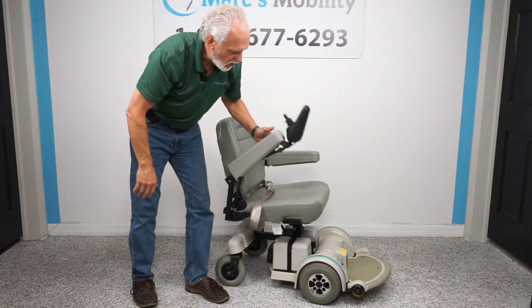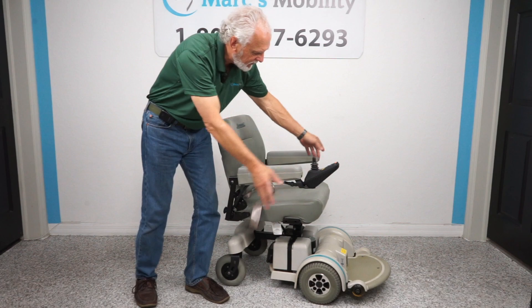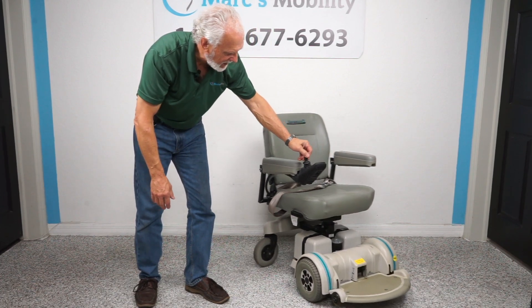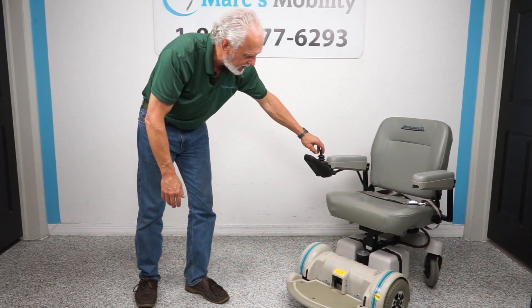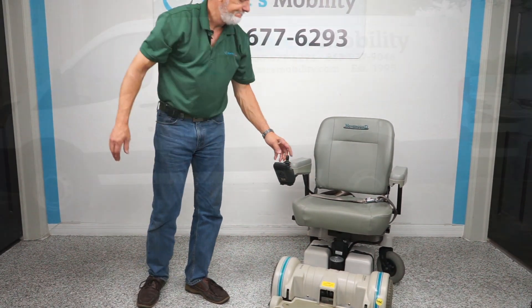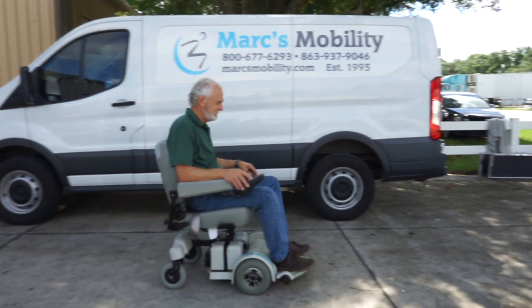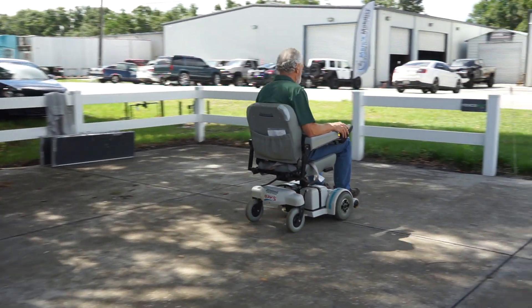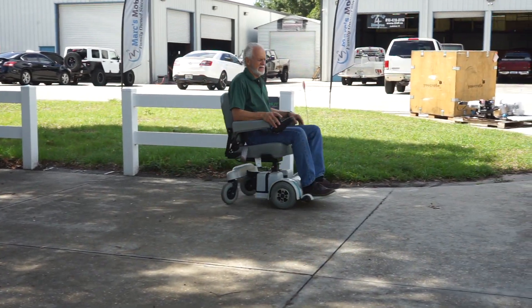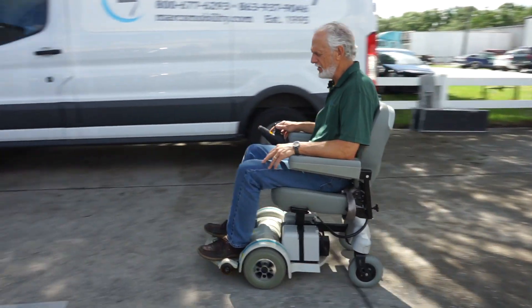So this is a Hover Around MPV5 with the five-inch seat lift, flip-up arms, 21-inch by 18-inch seat, and rounded foot plate. It's a pretty famous power chair — you see them all over the place. It's made by the Hover Around corporation, ready to go, with a top speed of about five miles an hour.